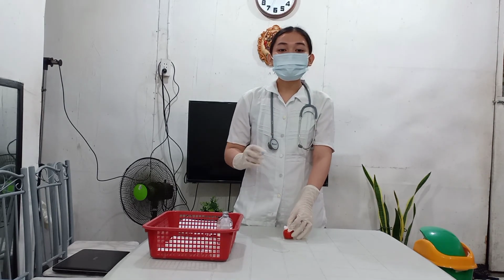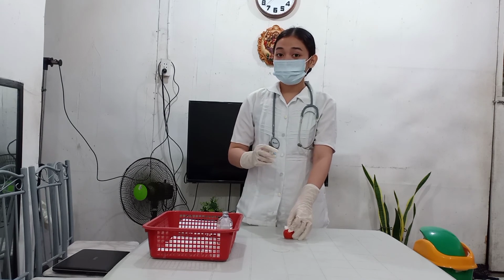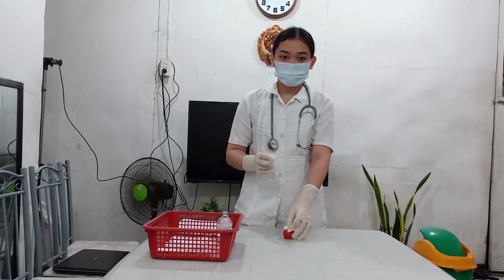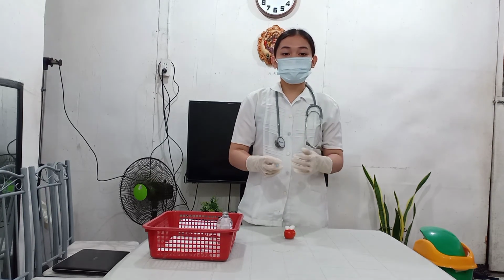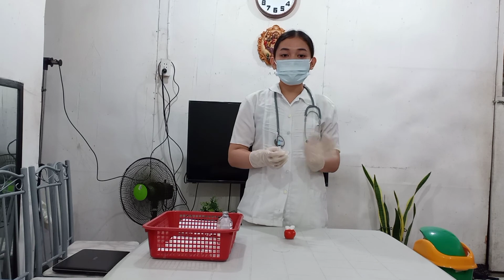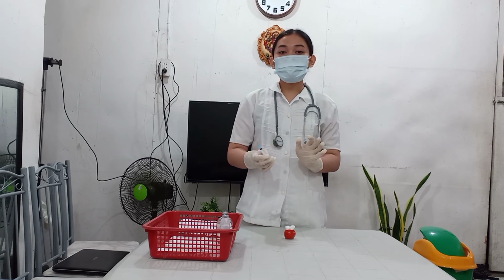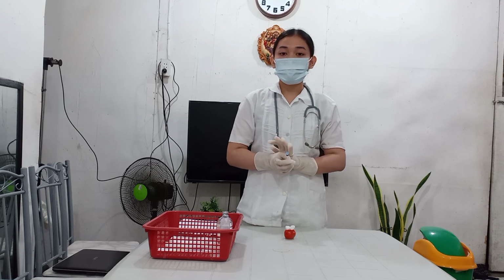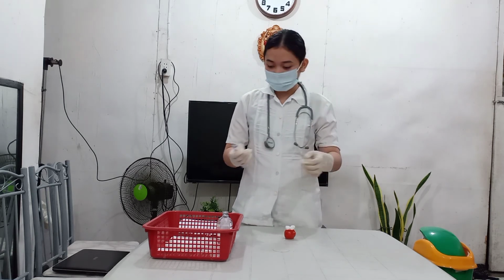After which, we assist the client to a comfortable position. This is to provide the patient's comfort. Next is to discard the uncapped needle and syringe in a safe receptacle. Most accidental needle sticks occur while recapping needles. Proper disposal prevents injury.